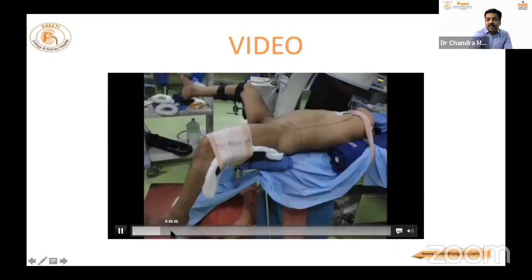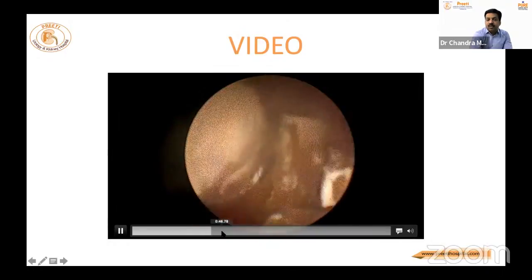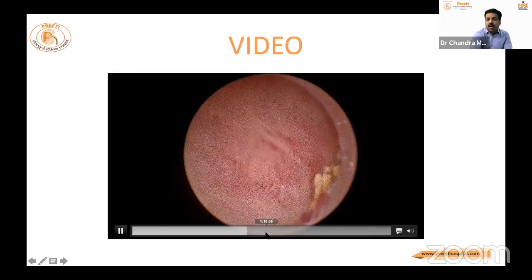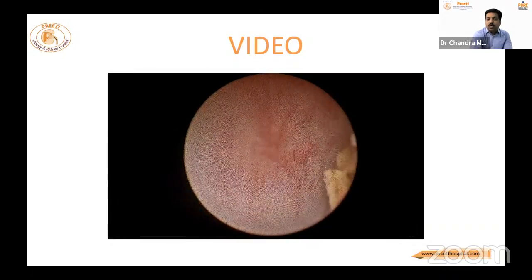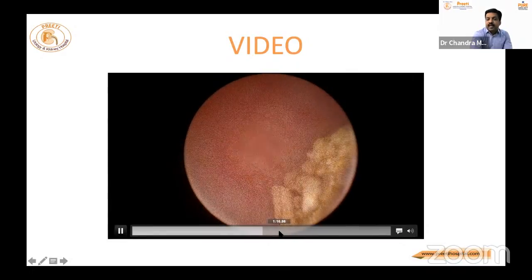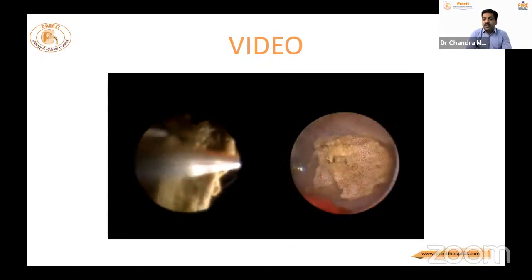This is a picture. This is a position. This is a puncture. These stones are like this. We use a pneumatic lithotripter for large stones, and then all of this is removed. Now I am not able to turn, as Kwon told. We cannot go into the upper calyx, no chance. Otherwise, the infundibulum will tear. The stone is partially visible. Now, what is the flexible scope person doing?